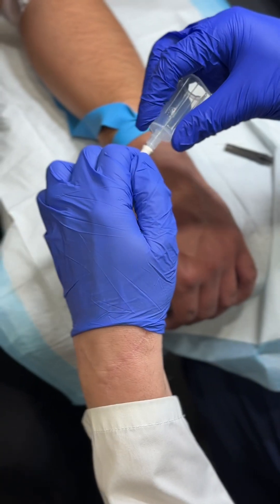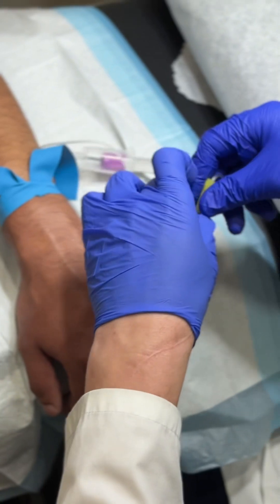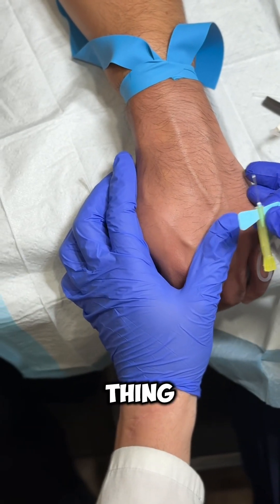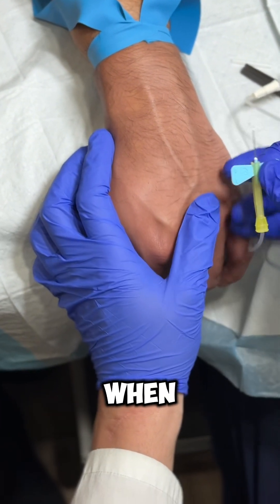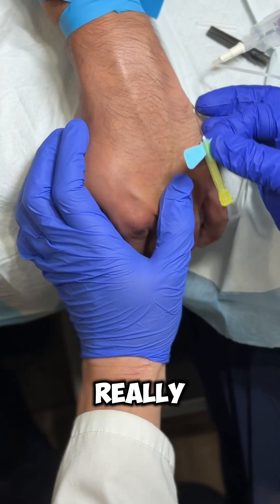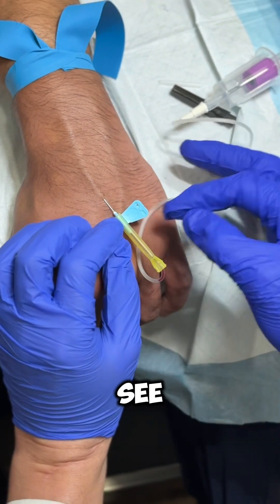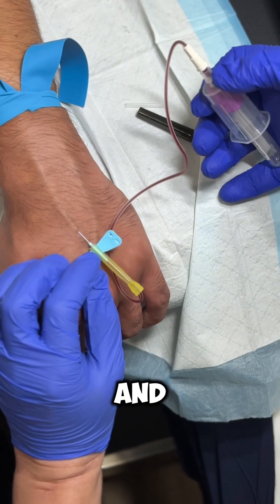If I put the needle in right away without stabilizing, it's just going to move around and come out. So what I do — some people do it differently, but I feel more control when I approach from the side. I can actually control the angle. Even though the vein kind of disappears, watch — I'm going to see the flash. One, two, three — low angle — and that's it. The flash confirms the angle of approach. You are in the vein 100%, without any question.